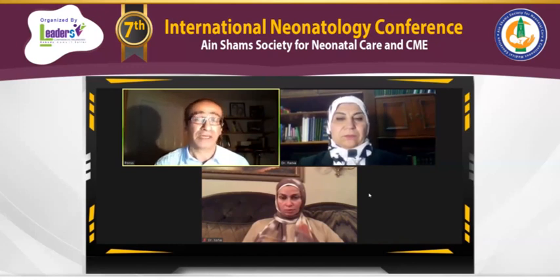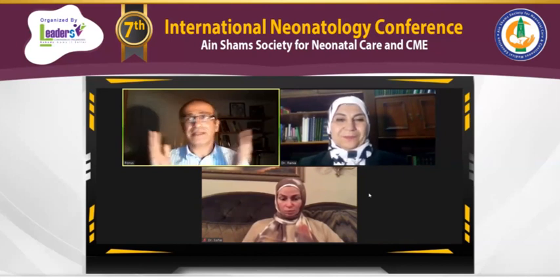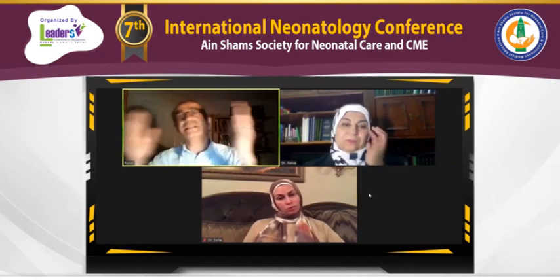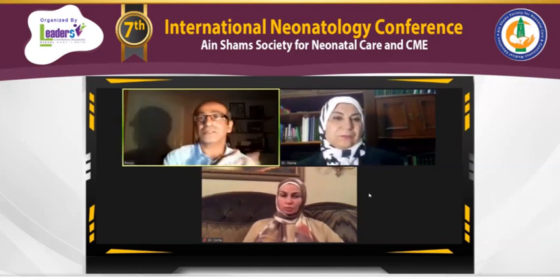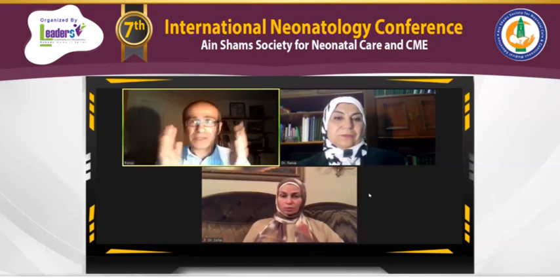People misinterpret things. And a really useful thing I find with using high frequency oscillation, exactly as Dr. Trujillo was very nicely saying, is that when you give surfactant, you really can lose the idea of, am I now over-distending my lungs? Am I under-distending my lungs? The baby desaturates on high frequency. What is going on?